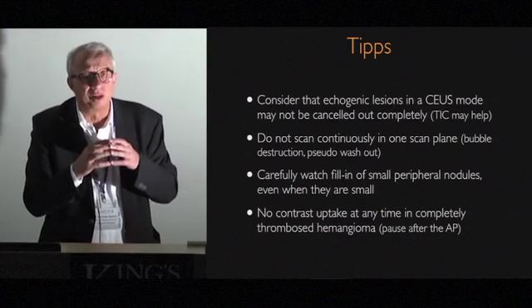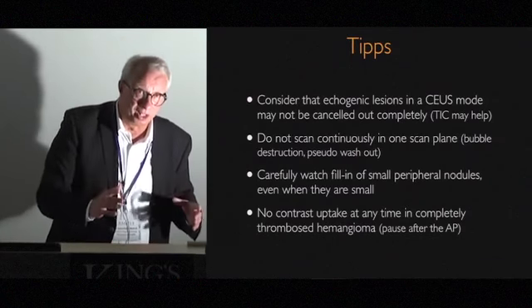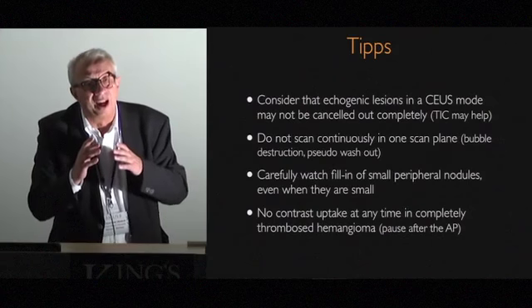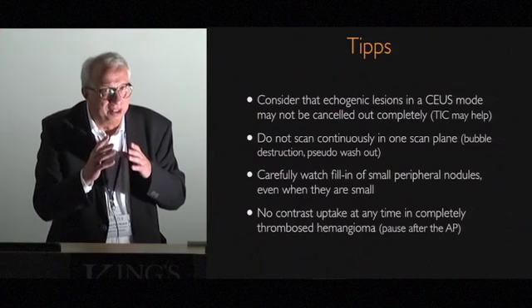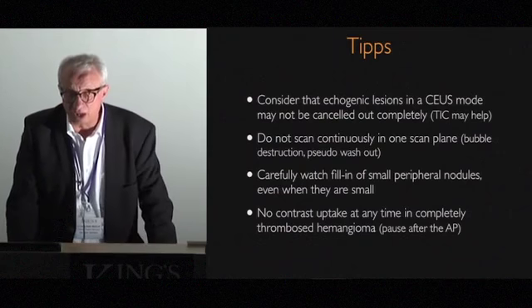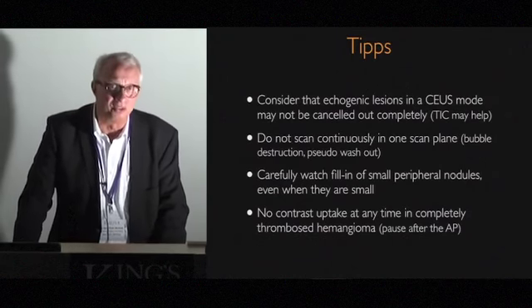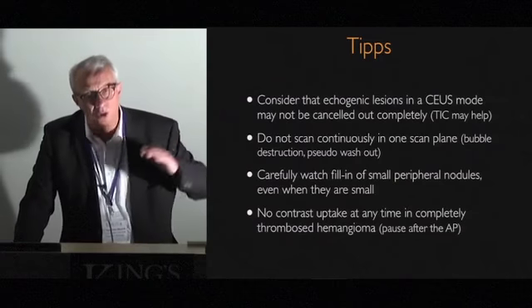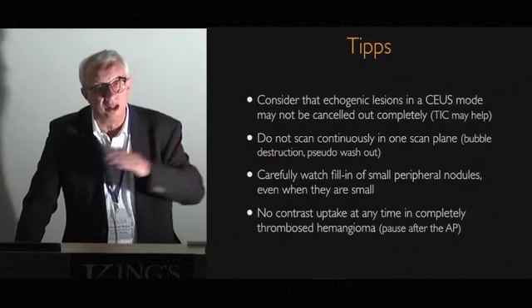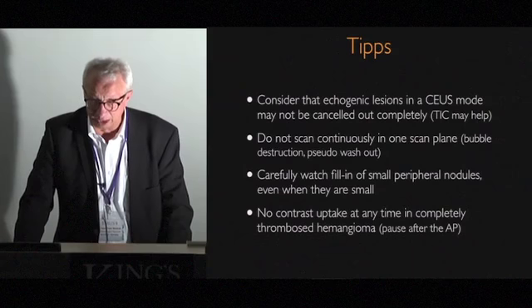And when you give contrast, and you see that the contrast is being washed out over time, then of course the hyperechoic lesion stays in the image. So that is something that you have to have in mind, and a TIC technique may help to see if it's really washing out to the level before contrast injection.